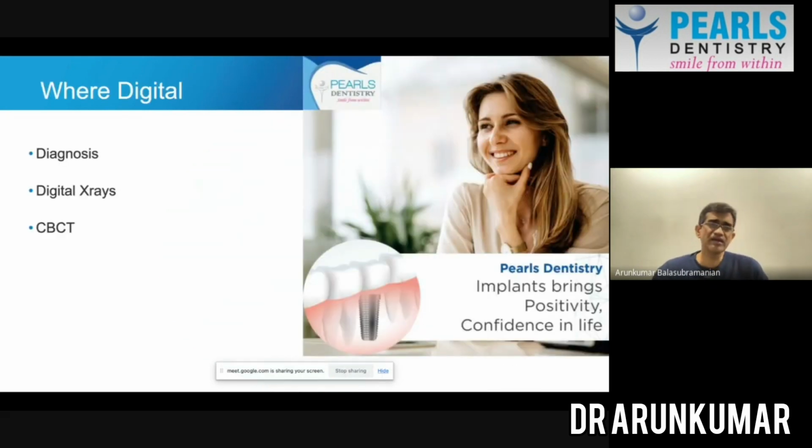So now let's look at where all digital dentistry has evolved. The first thing we need to understand is in terms of diagnosis and treatment planning. So when it comes to diagnosis and treatment planning, the tools that we generally used beforehand have now greatly been enhanced with the introduction of a lot of digital aids. We have digital x-rays where we can digitally record the patient's tooth, and those digital x-rays are only a two-dimensional view of the patient's teeth.